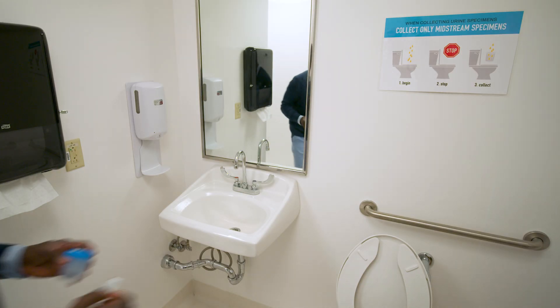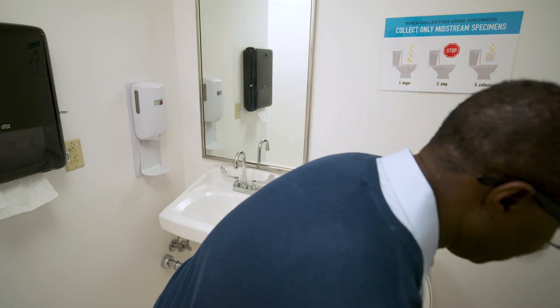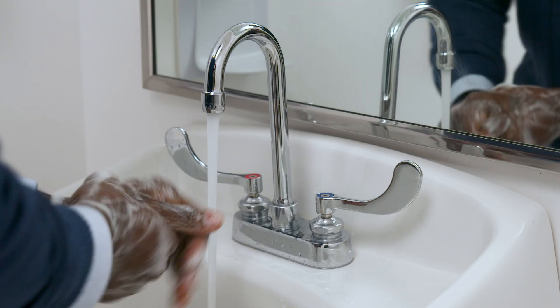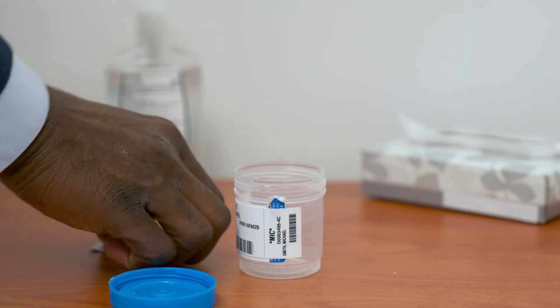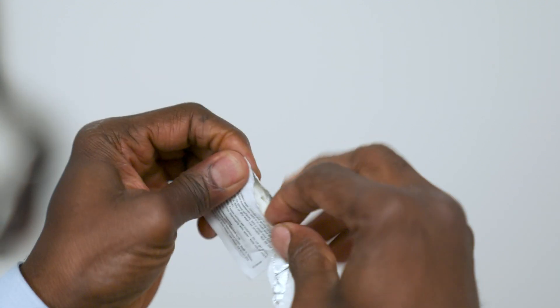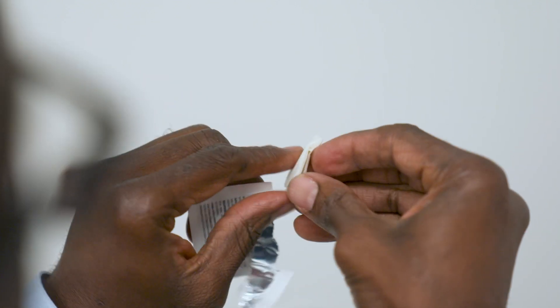Then I was in the bathroom. First, hand hygiene. Open the container without touching the inside of the cap and container. Towelettes are used to clean around the urinary opening.